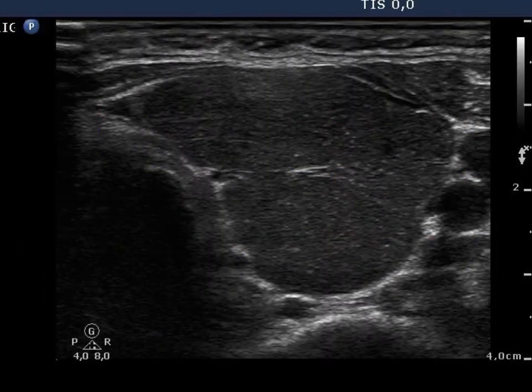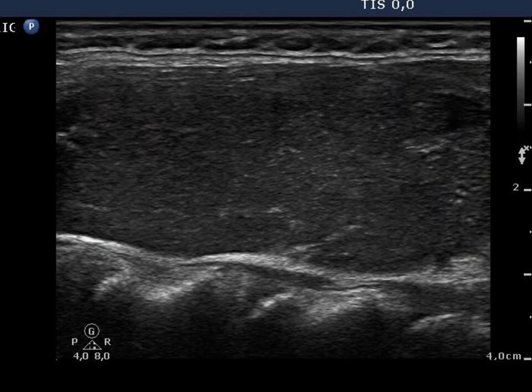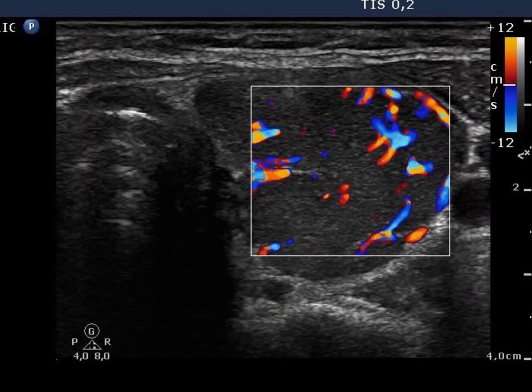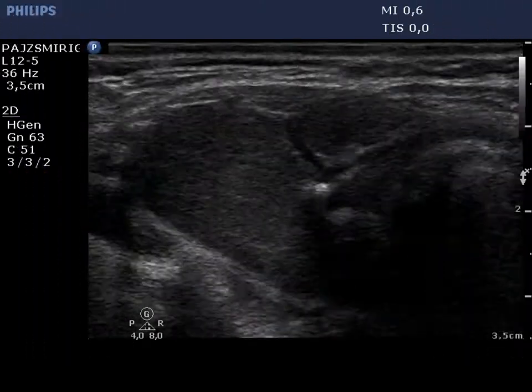Images of the left thyroid are shown. Note the presence of fibrotic changes. The vascularization is increased in this lobe.